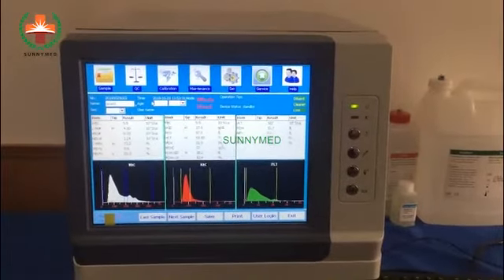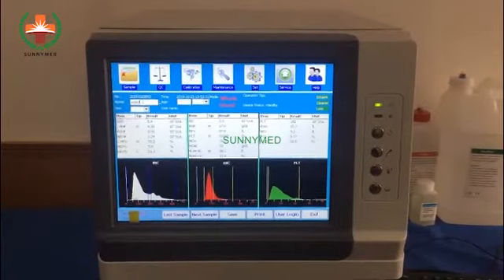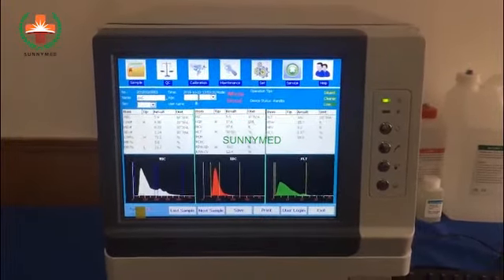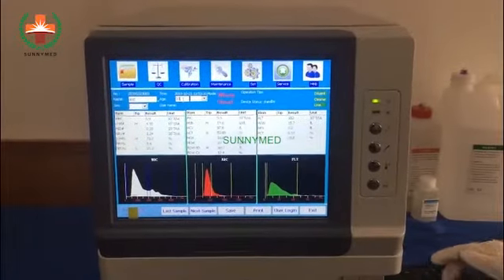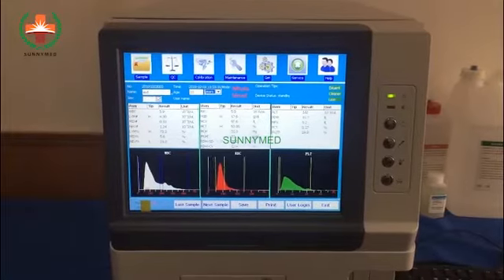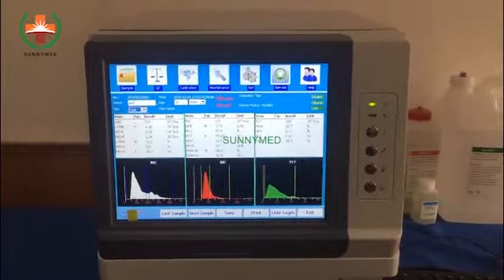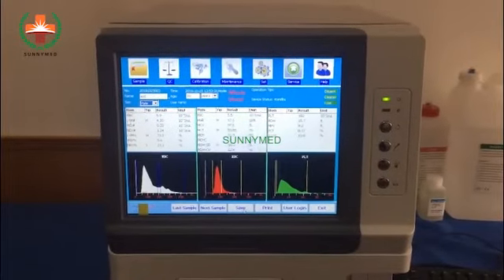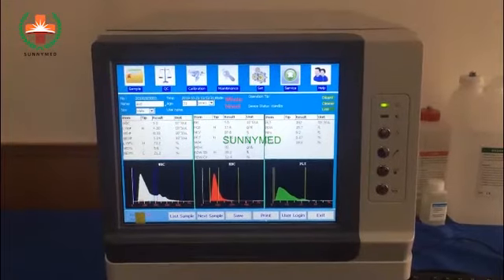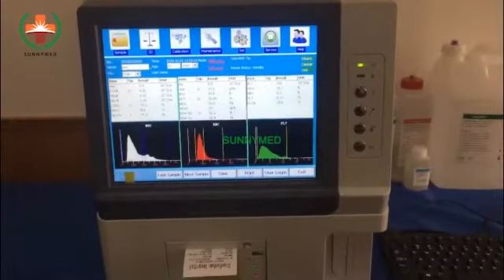Fifth, we can input the sample information such as the name, age, sex, then click save. Click print. The test result can be printed.